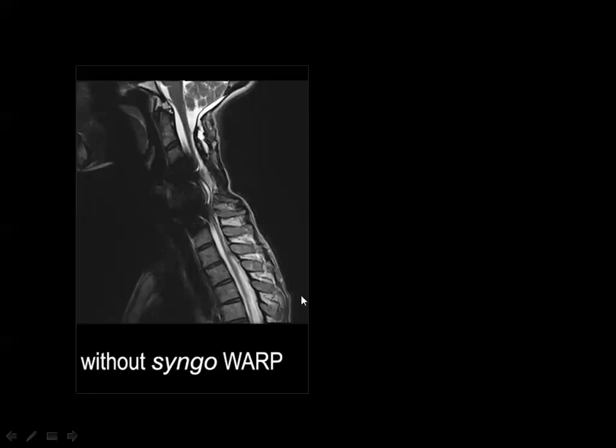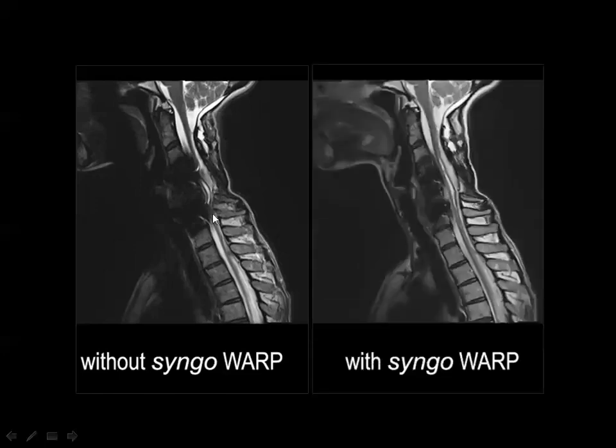You can see a patient with previous disc operation in the cervical spine. Too many artifacts have resulted from the disc cage and obscured the region of the spinal cord. Then after you use this artifact-free technique, you can remove the artifact and you can see the changes in the spinal cord, as you see here.